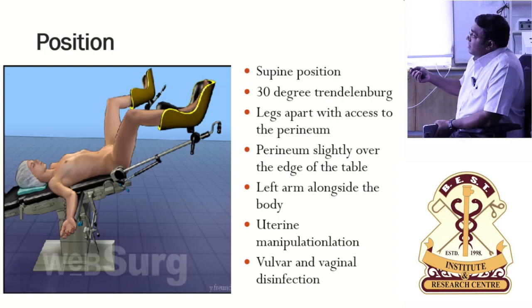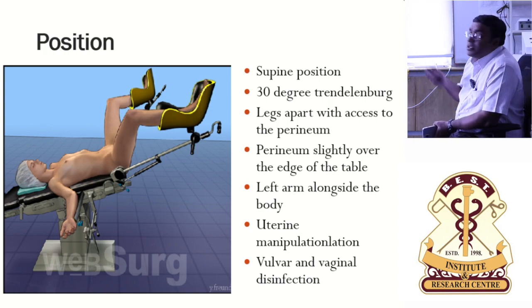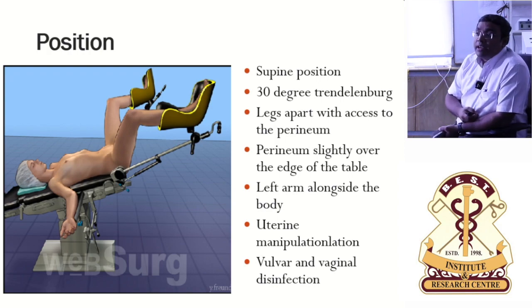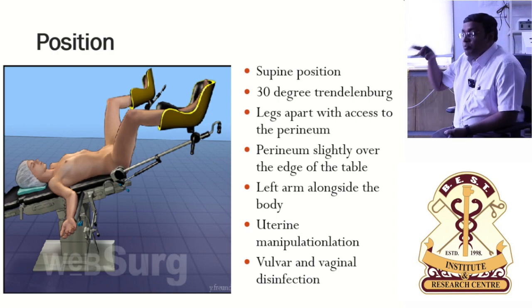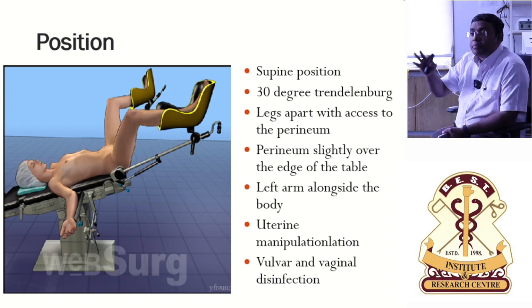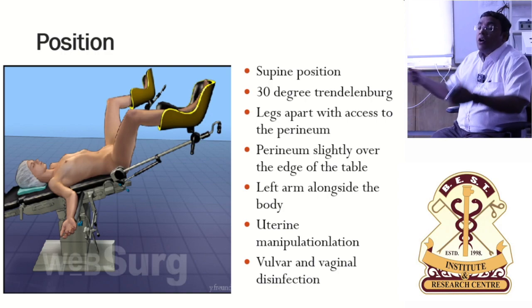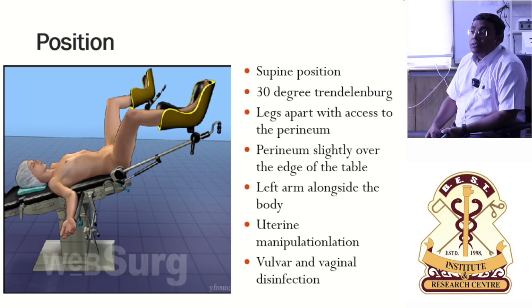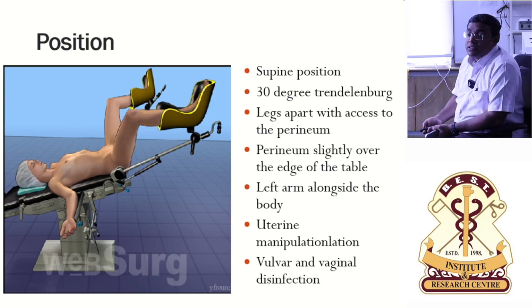Second thing is, you all are commonly seeing stirrups where the knee joint is supported. That's not a good support. Ideally, this is a good support. This is one of the best kinds of stirrups you can get. This is a vacuum based stirrup. Here you have the handle. So you paint and drape the patient. The surgeon himself can actually tilt the patient's legs however he wants. Okay, so this is an extremely good one and an expensive one, this stirrup.